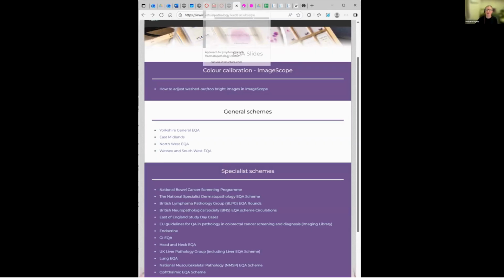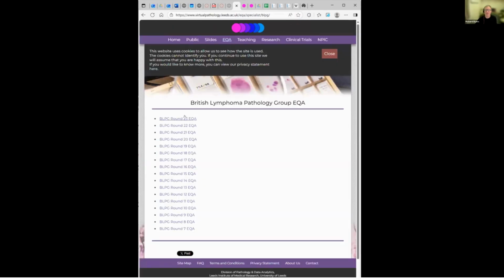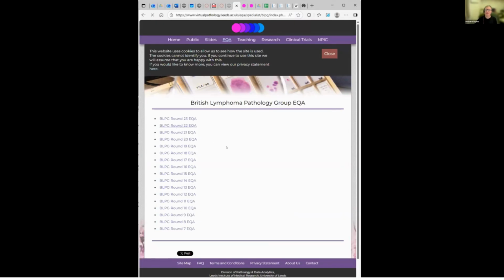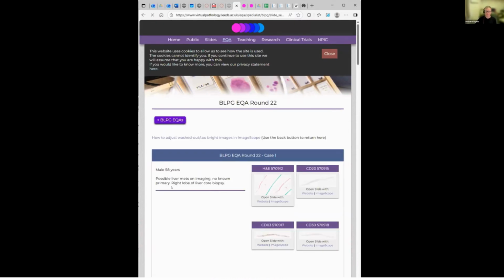So without further ado, we will look at what I said I would do, which is this EQA. I've just done round 24, but round 24 was for the EQA members and is not yet on this website. No, it wasn't actually. It was round 22 I was going to do. Yeah, round 22 I'm going to do. Right, so I need to get my screens together.